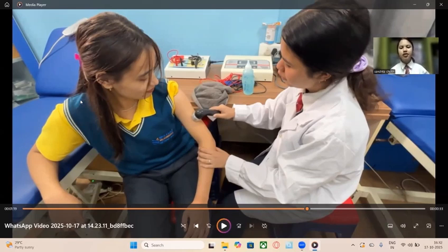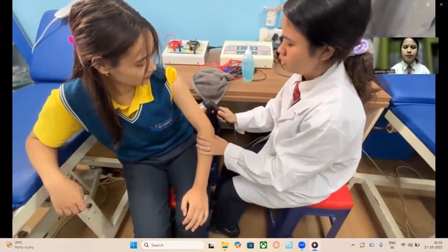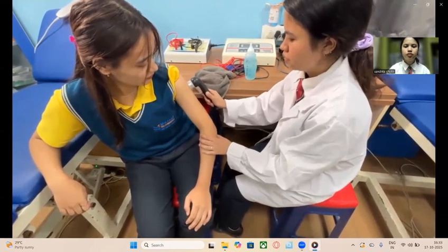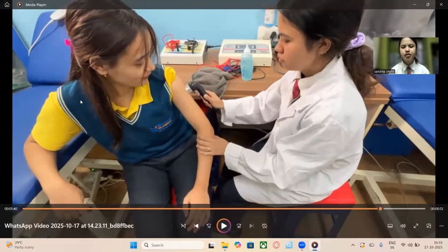It's important to keep the transducer moving continuously to prevent any tissue overheating. The patient may feel mild warmth, but there should not be any pain or discomfort. From time to time, I was making sure that my patient does not feel any discomfort or pain.